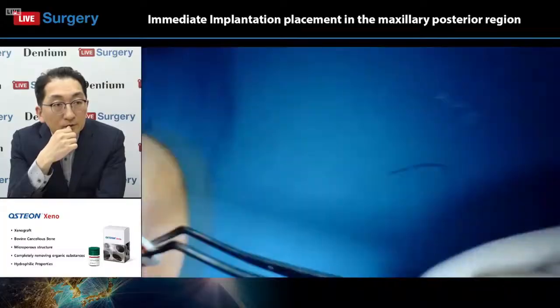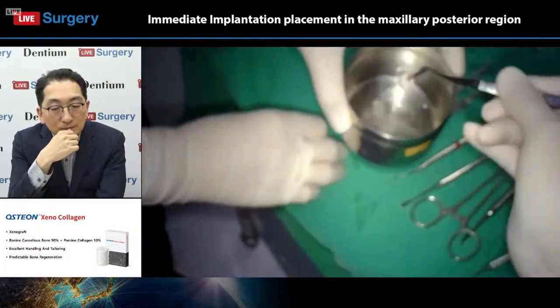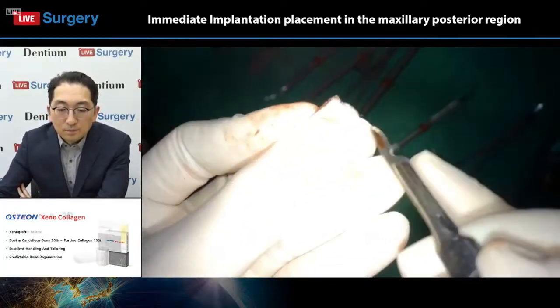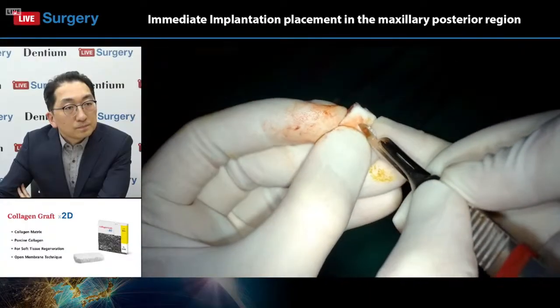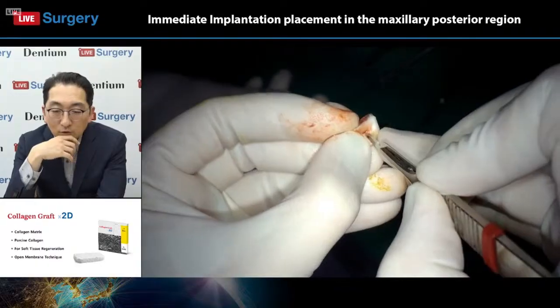For the 27 extraction socket, a collagen graft was placed over the top to allow open healing.